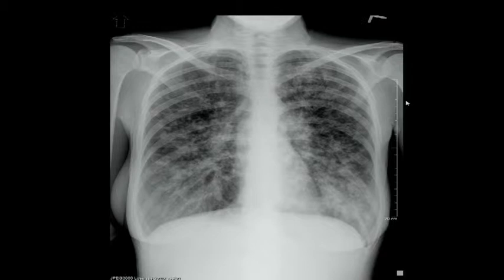This is larger than miliary. This cannot be miliary. This is much larger than miliary. Miliary is millet or pinpoint size. Okay. So let's start fresh.